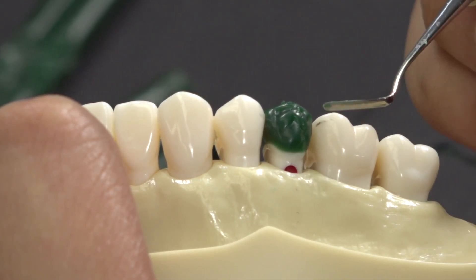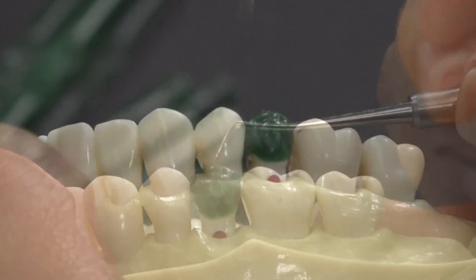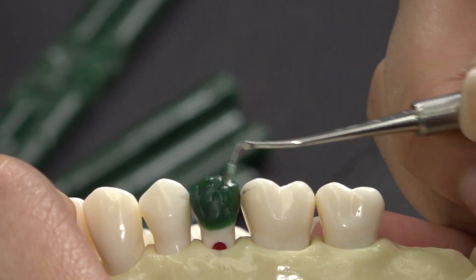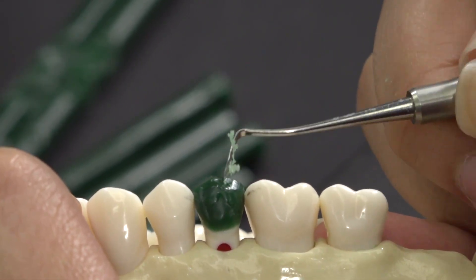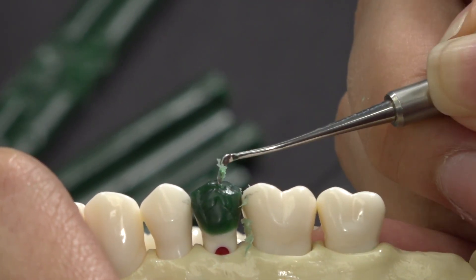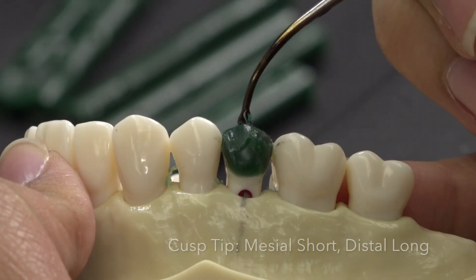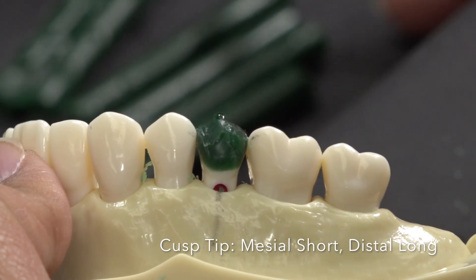Remember that number 4 is a diamond shape. You can use any kind of carver to shape the wax — I will be using the IPC. Start at the highest point, which is your cusp tip, and shave downward toward the adjacent teeth to help create the diamond shaped facial. You can use the adjacent or contralateral premolar as a visual reminder to make the tooth sharp and not flat or rounded when carving. Remember that the mesiofacial line angle is shorter than the distal because it flares more towards the mesial.